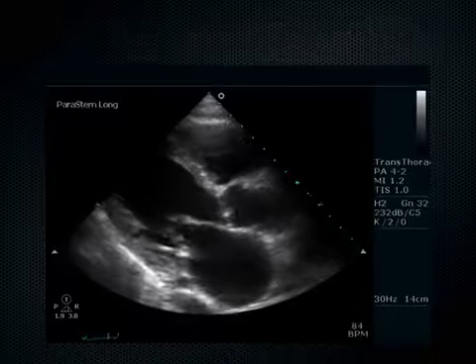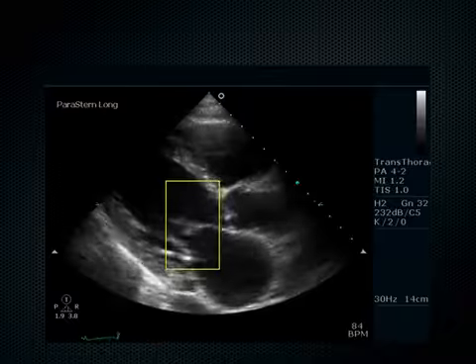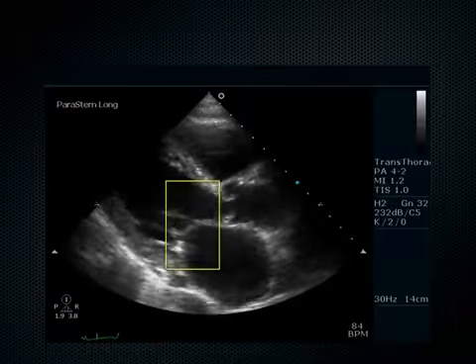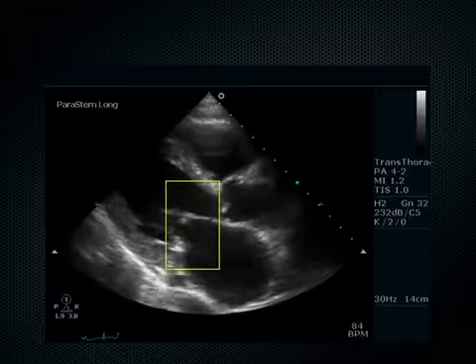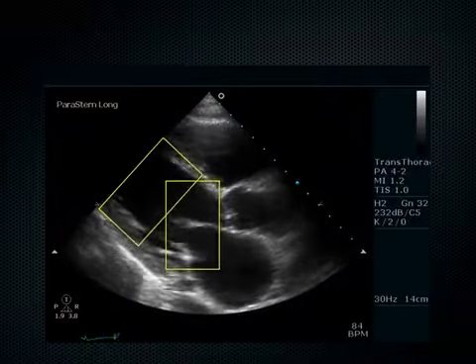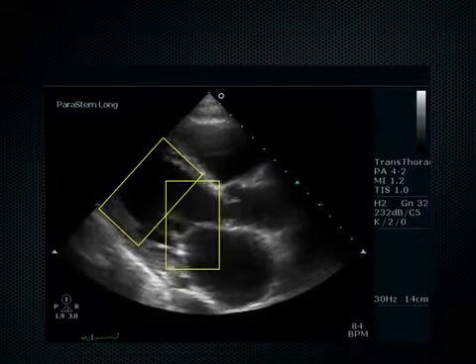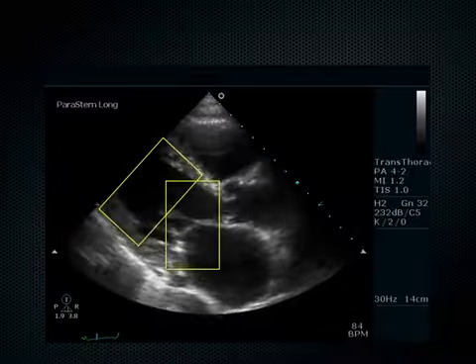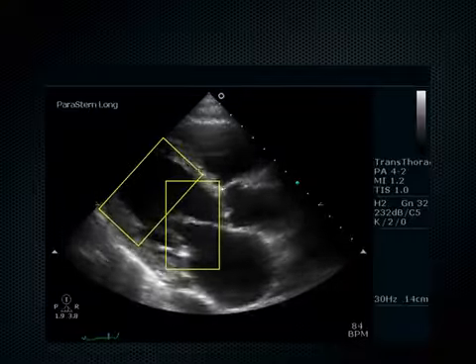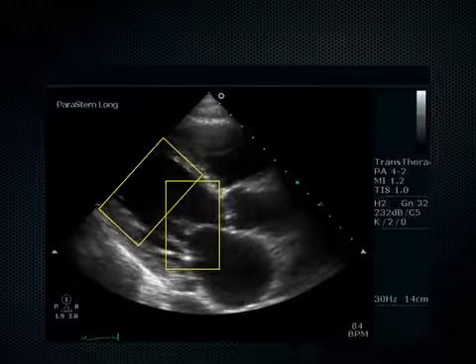How we doing here? Bad. Yeah. Does that valve come up and hit the septum? Nope. There's some pretty decent looking sequentiality, but it's not moving much. How about back here? Do we see the septum coming into the LV? Nope. This is really easy to do. You can do a kinesis assessment very simply at the bedside. Anytime you've got a patient who's got hypotension, it's indicated to do this.